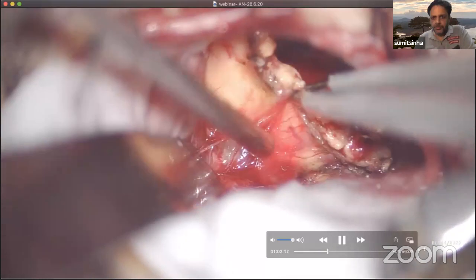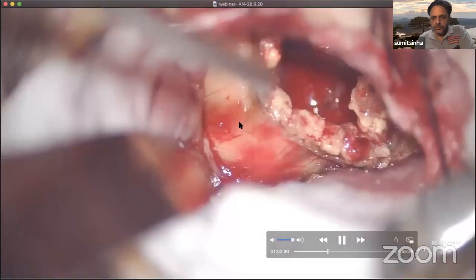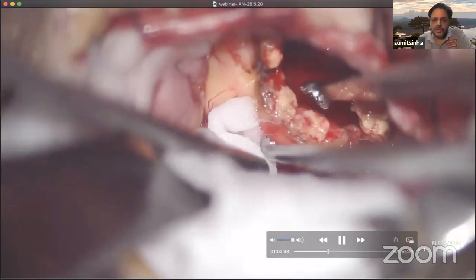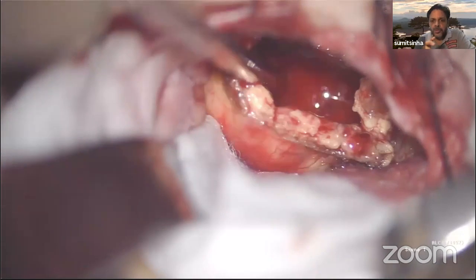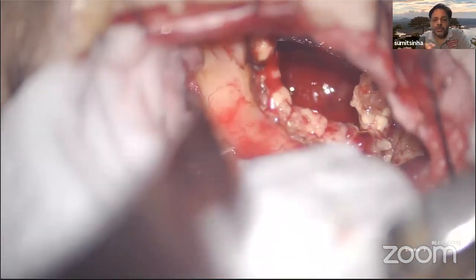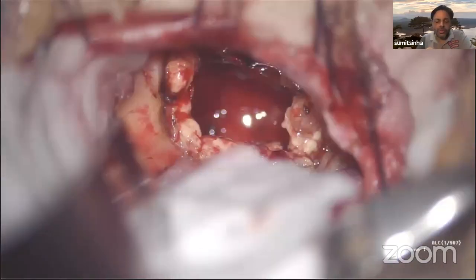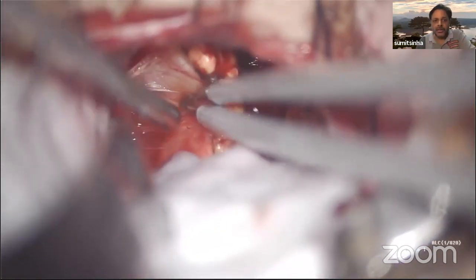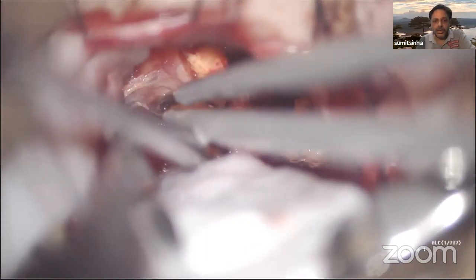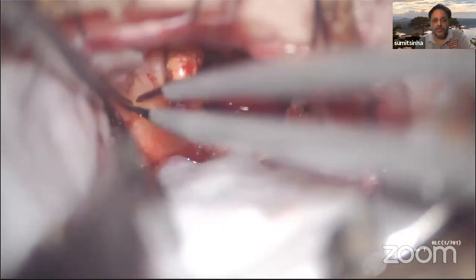This is the superior part of the tumor. At any point that you feel the tumor capsule is not manageable and is not able to be lifted up from the surrounding structures, this means one thing: your tumor is still bulky. The most important thing you need to do at that point is to debulk the tumor with your CUSA. You have to be very judgmental in this. As you see here at the superior pole, there is a big chunk at the upper pole, which is why this tumor capsule is very resistant to handling and lifting up. In a short while, you will see that after decoring and debulking, it's very easy to separate this superior pole from the surrounding structures and then peel off the arachnoid membrane from the superior pole of the tumor.